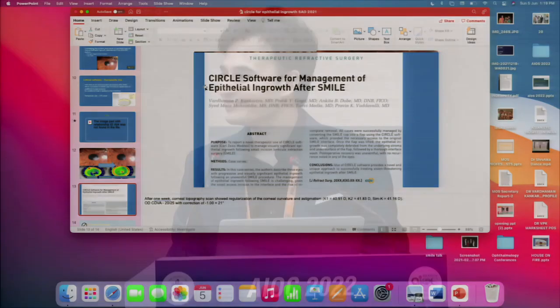Thank you. Beautifully managed, and I would have done exactly the same thing because it is so central. If you try to pull it from the smile incision, you will leave some epithelial cells for sure. Absolutely. And they will again proliferate. Absolutely. There is also a chance of creating a new epithelial fistula. Exactly. So it can go into the recurrence course. Which was not connected to the wound, now will be connected to the wound. Absolutely. Well managed. Good job. Thank you.